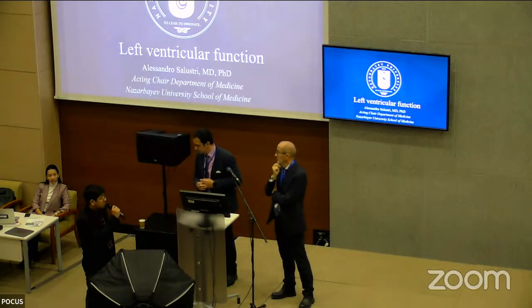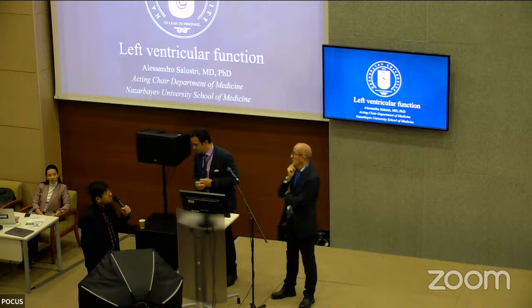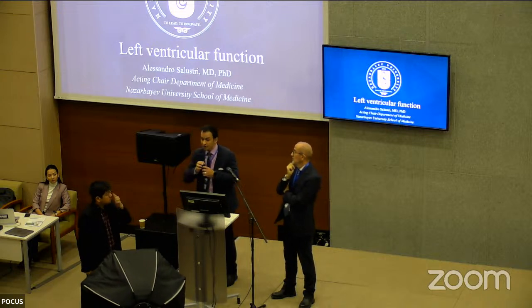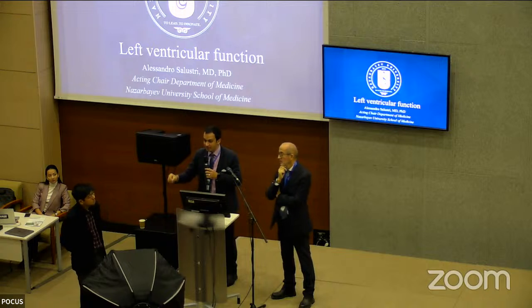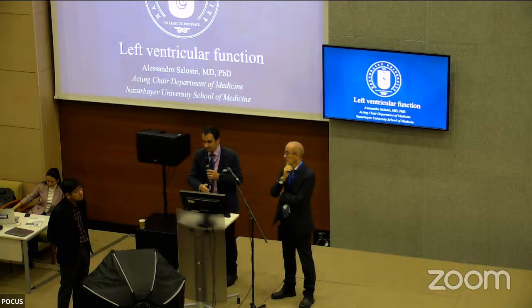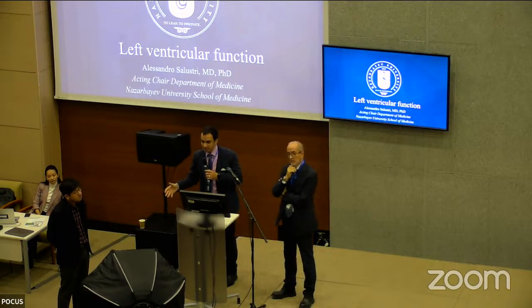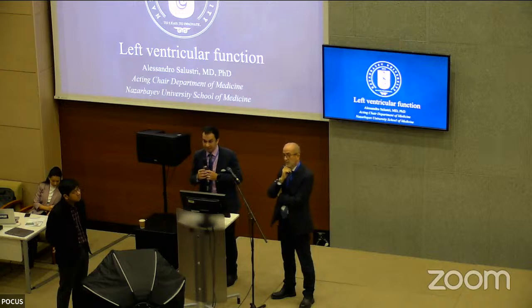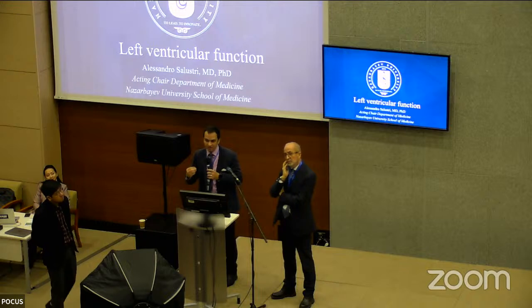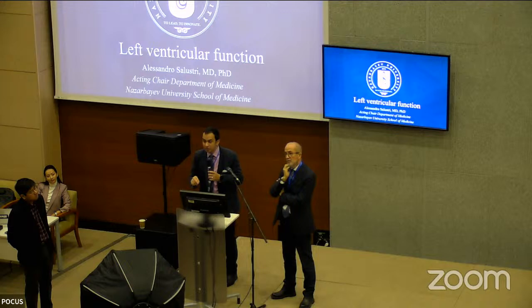Do we need to measure cardiac index with the body surface area in these cases? Yes. So when you estimate cardiac output by the LVOT VTI, you do the stroke volume, cardiac output, and cardiac index. So that's the way to do assessment of perfusion using the pulse wave Doppler. But yeah, my message is in hemodynamic instability, ejection fraction is not reliable, and you will not see it in any of the definitions of shock.